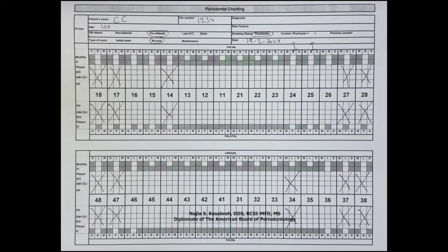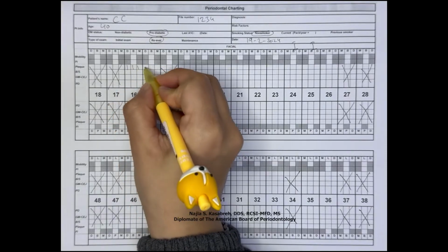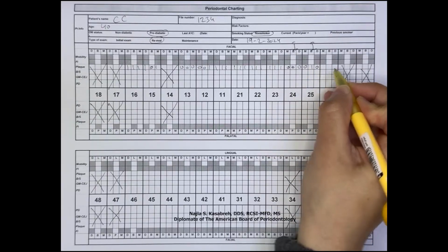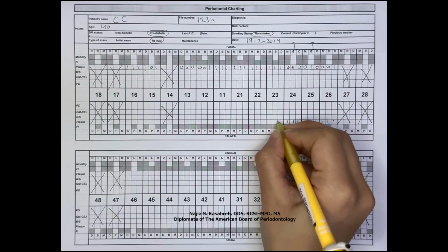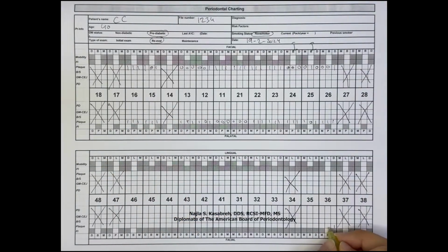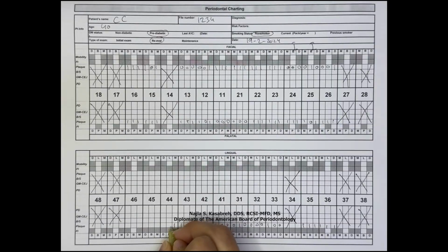The first score to be recorded is plaque score to avoid disturbing the plaque during periodontal probing. As previously mentioned, commence the examination from the upper right side, specifically from the distobuccal aspect of the most distal tooth. Assess whether plaque is present using the probe, recording a value of 0 if absent and 1 if present. Repeat this procedure for all sides, ensuring comprehensive coverage, and report findings to your assistant. Progress systematically around each tooth, assessing the distobuccal, midbuccal, and mesiobuccal aspects before transitioning to the subsequent tooth. Once plaque presence is documented, calculate the percentage using the provided equation.